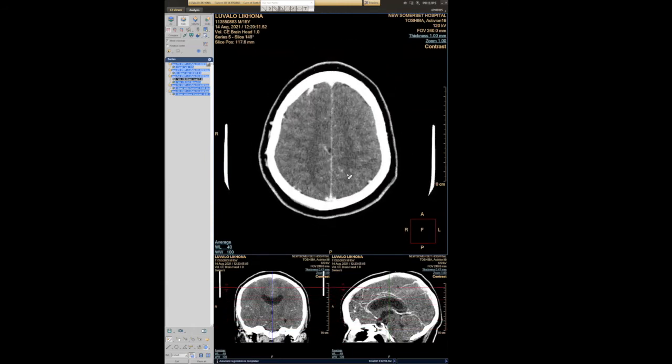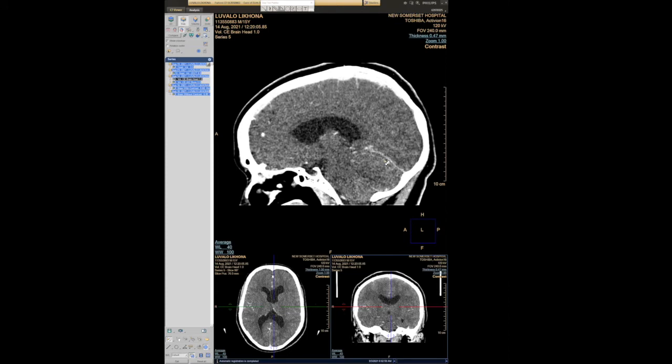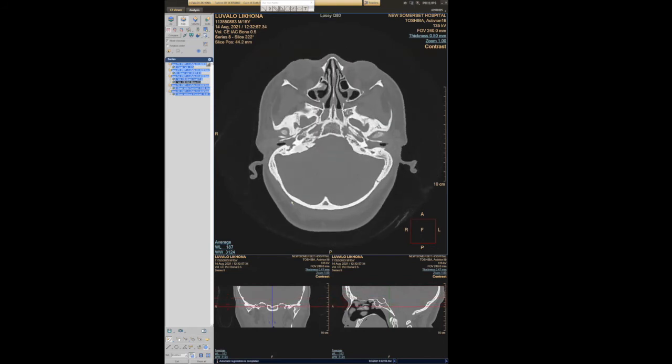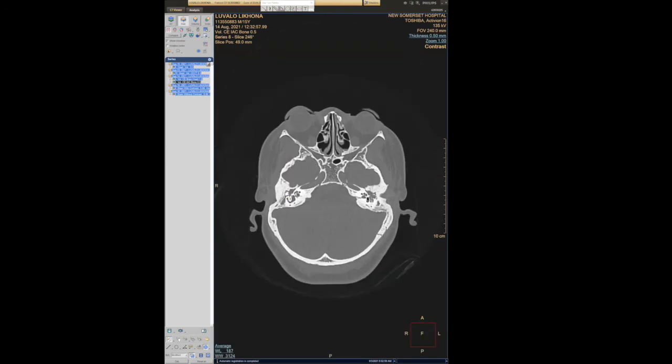So in summary, because of the extensive underlying bone erosions, we thought this underlying cholesteatoma is likely, and it's complicated by intracranial collections and cerebral edema, but there's no dural venous sinus thrombosis. I just forgot to mention that on the other contralateral side, there is also a lesser degree of the disease on the right side. We can also see complete opacification of the middle ear and mastoid air cells, but the ossicular chain still remains intact.